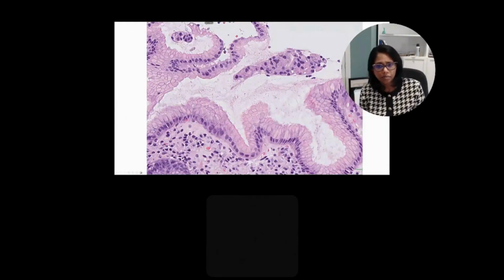This is a higher power image to see where you may typically look for these organisms. They usually are embedded within the sea of mucin and the surface epithelium. And when you see this, Bob's your uncle. You're delighted because you actually can find them. When they are within the pits, they are a bit more challenging to find, and certainly if they are not in abundance, it's always a struggle. And it's always described as a flight of seagulls.